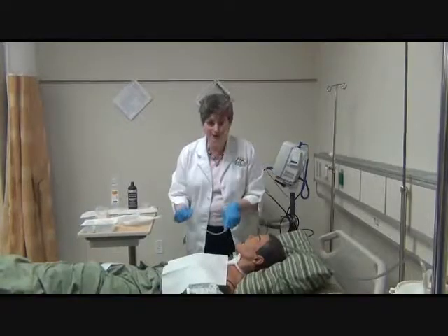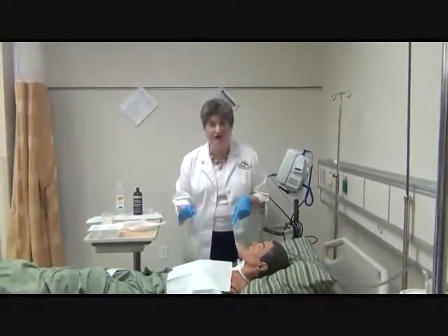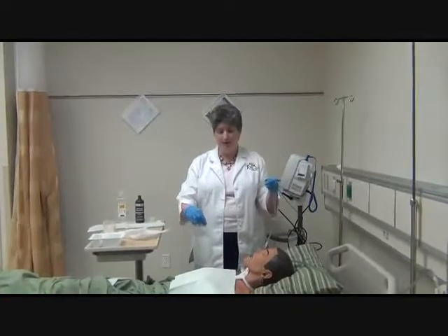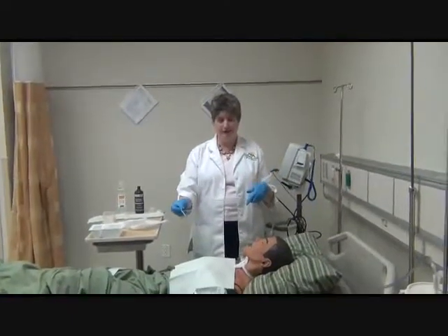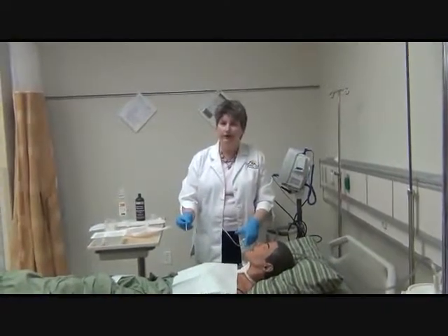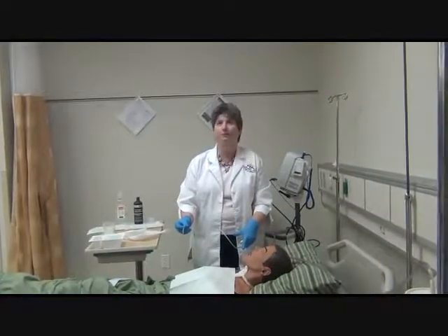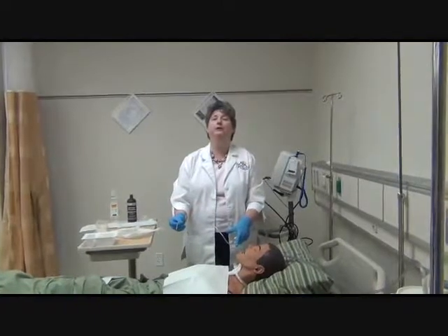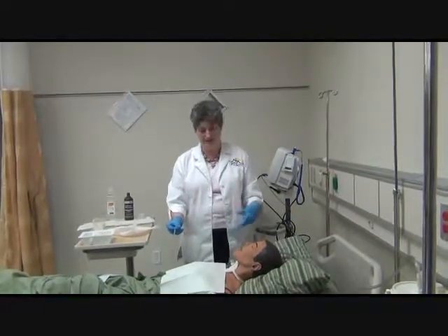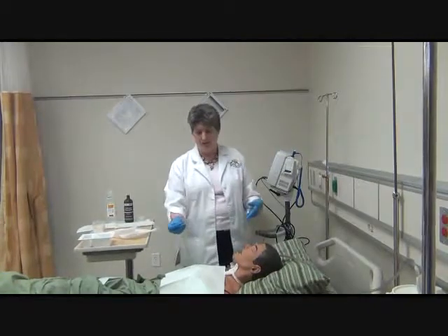Expect your patient to cough, so you never want to just look down into the trach or you're going to get a face full. So you want to always kind of stand off to the side from the patient, have good access with their neck. Now your human patient is going to be more pliable and softer. You can get their head backwards a little easier. This mannequin's chin tends to get in the way, but we're going to try that.